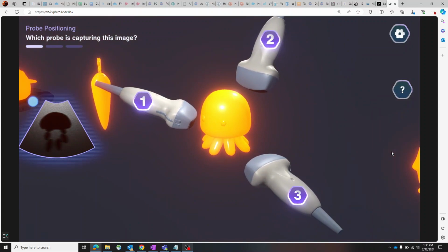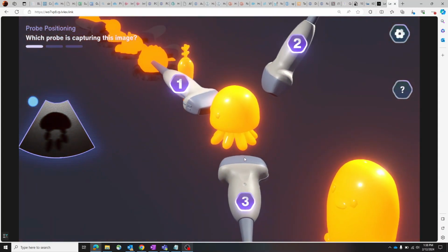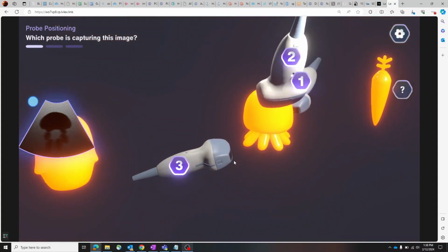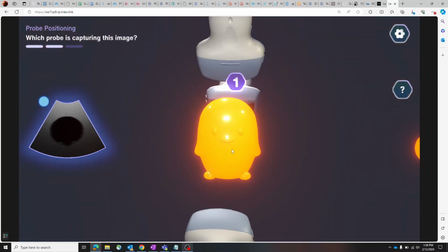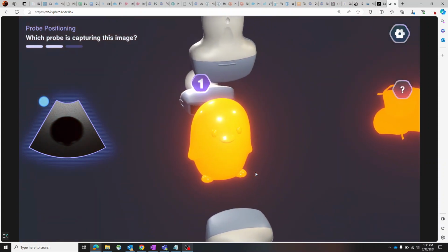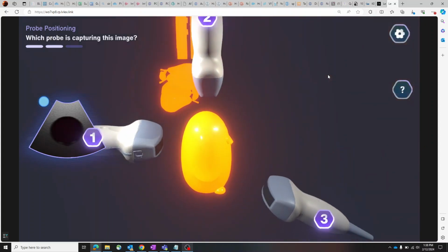A comment, if I may. Since I'm a co-investigator on this, you just saw a hypothesis and heard that this will improve actual performance in a real ultrasound imaging scenario, right? So the next phase of this is, many of you will probably see or hear an announcement that we're recruiting test subjects with ultrasound experience to use this as an intervention to measure the teaching effect.